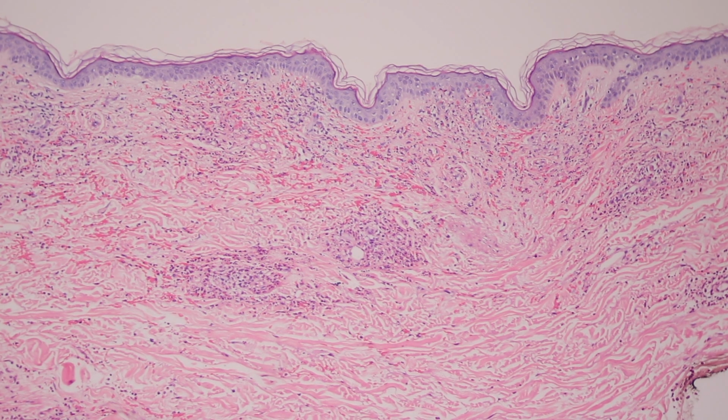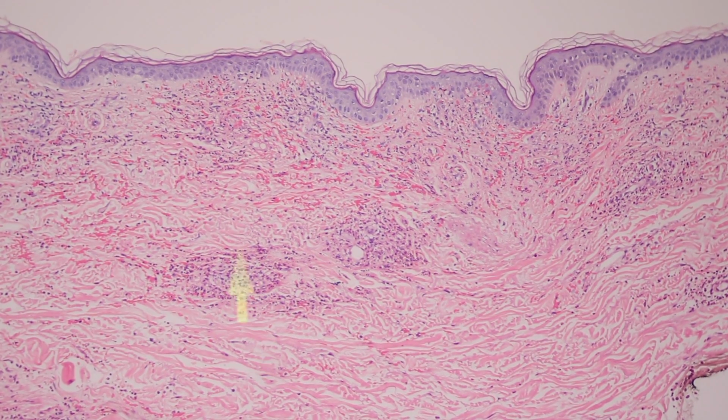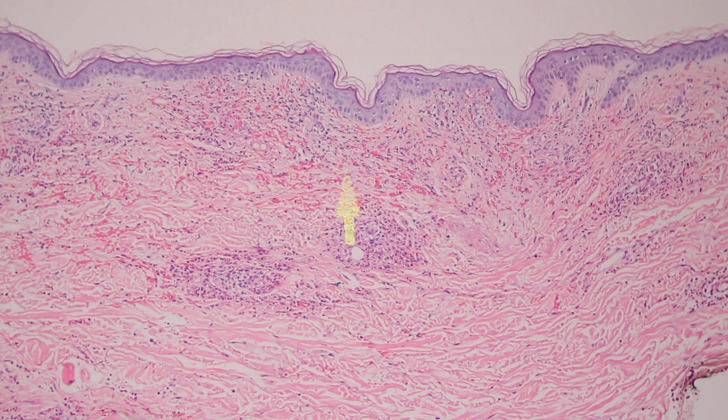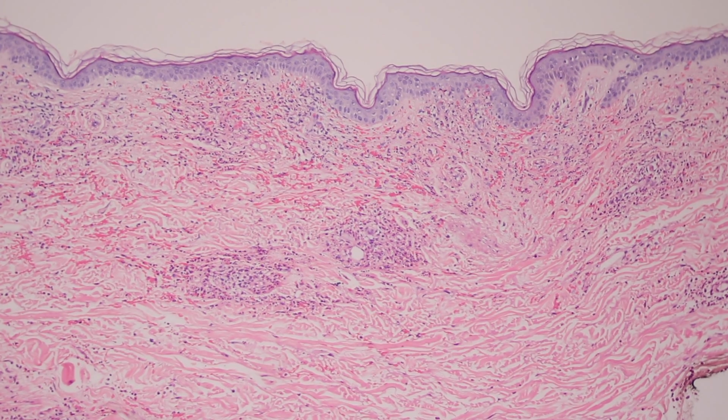So the key from low power, I think, is whenever you see clusters of what look like neutrophils clustered in the dermis like this, you right away should think of leukocytoclastic vasculitis. And also, if you see a lot of hemorrhage in the dermis, you should instantly think, could this be vasculitis? And then go down closer for inspection. And in this case, even from here on 10x objective, we can see that this is going to be a nice example of leukocytoclastic vasculitis.